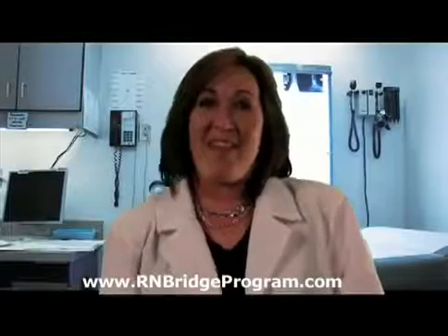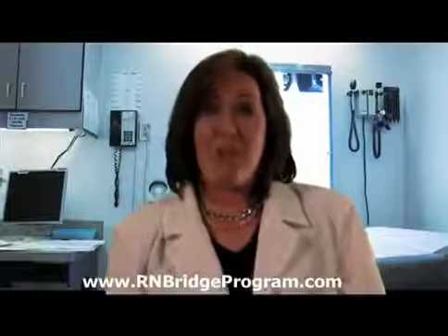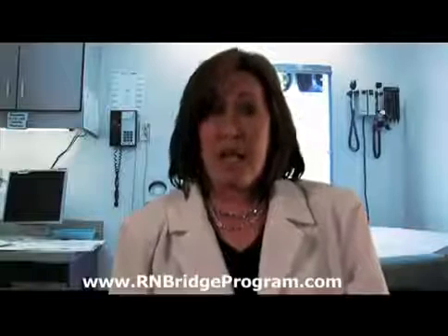Okay, so that's how you give an IM injection in the gluteal muscle. Now FYI, after you give the injection, depending on what type of medication you give, you may be able to massage that area. So make sure that you look in your drug guide to see what's appropriate as far as a massage and what is not. You can also cover the area with a Band-Aid in case it is oozing a little bit. Also, as you well know, there are many different locations for landmarks. This is just the particular one that I'm teaching you on today.